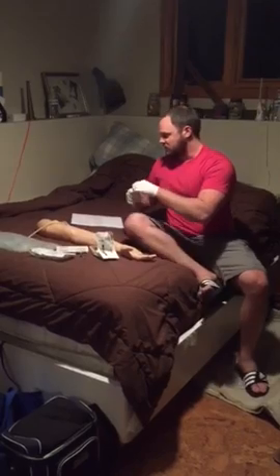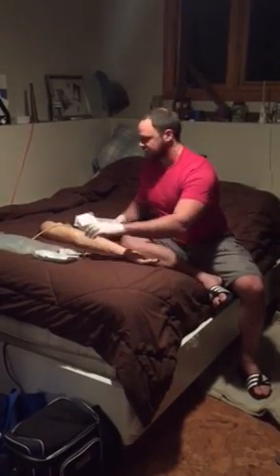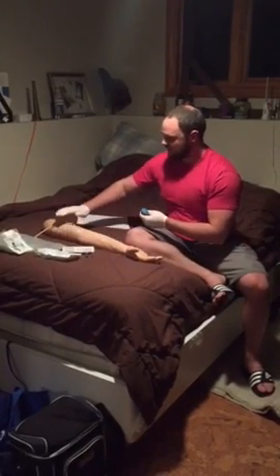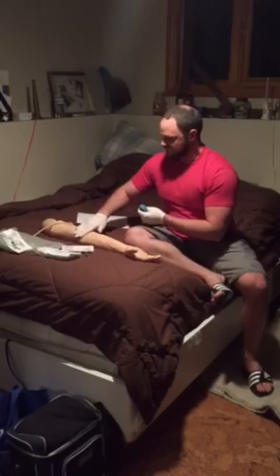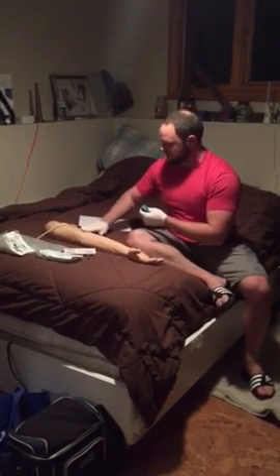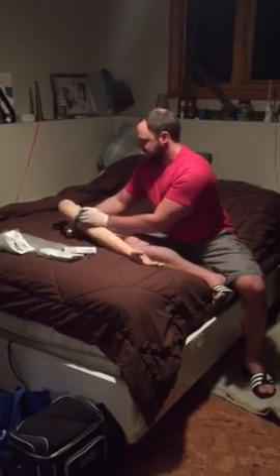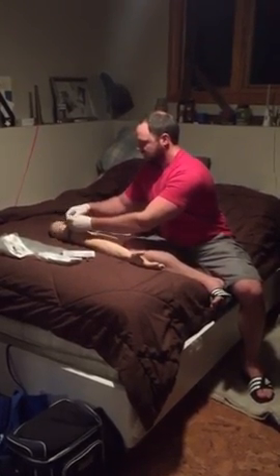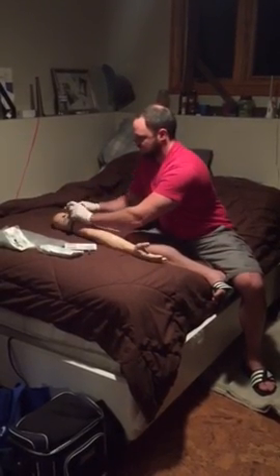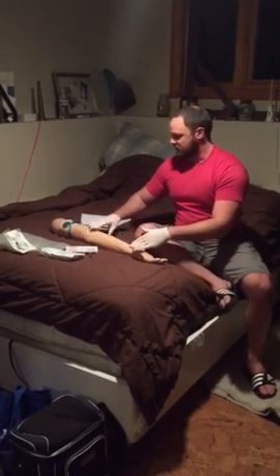and we are going to, typically you want to go a couple inches, 2 to 3, above the site where you want to do your stick. So this is technically this arm's antecubital fossa, the AC area right here. So just to keep it out of the way, we are going to ramp up here. And then after that, let gravity help us.